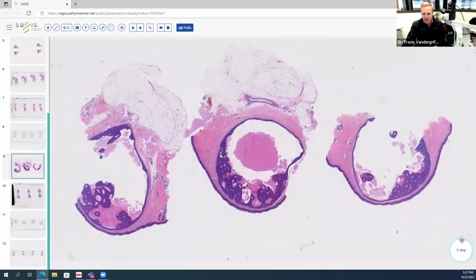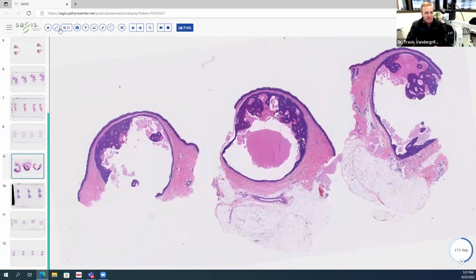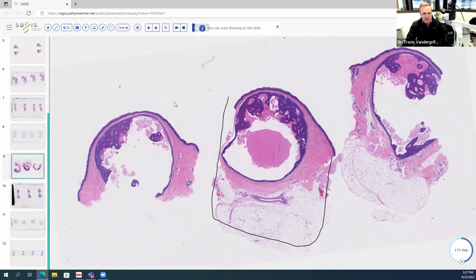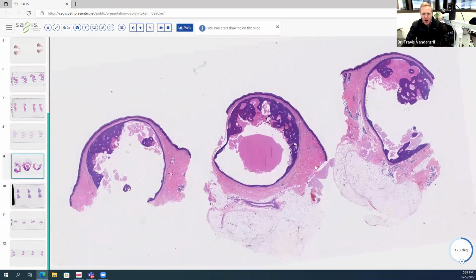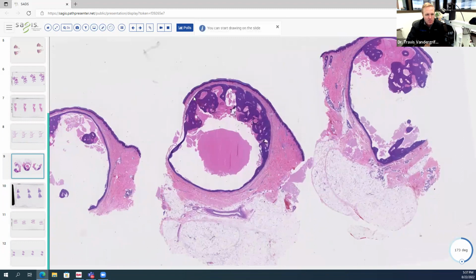Going on to our next case, we have an excision. So this is a larger neoplasm, and it's excised down into the subcutis. And the neoplasm itself is situated in the dermis. Although it's large, it does have a benign silhouette. It's very sharply circumscribed, very easy for me to tell the boundaries of this neoplasm. And it's symmetric appearing. If I draw a line through this, one side looks pretty similar to the other with respect to the bulkiness or the architectural configuration.